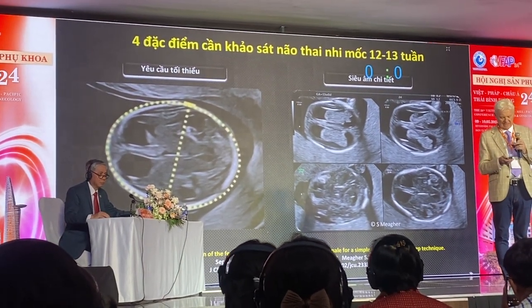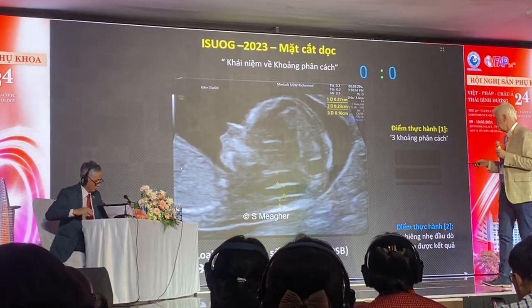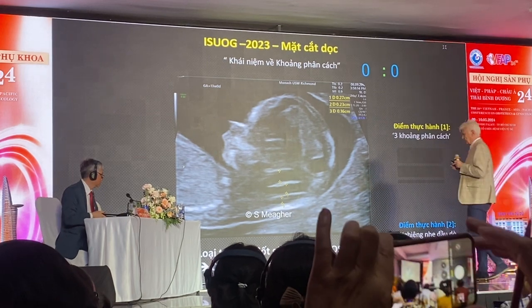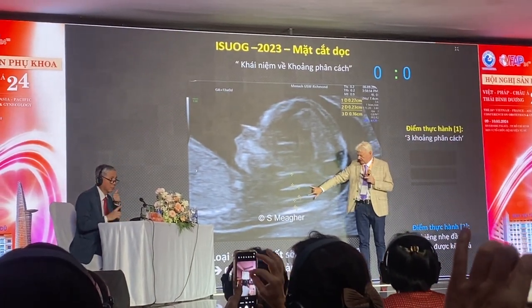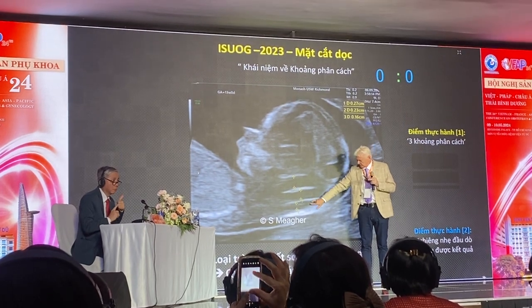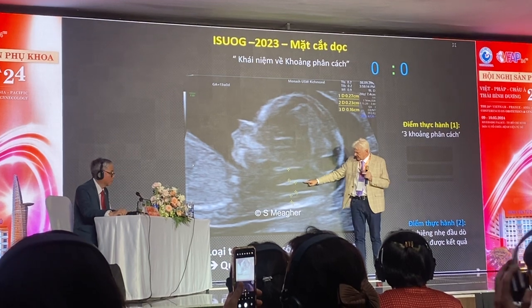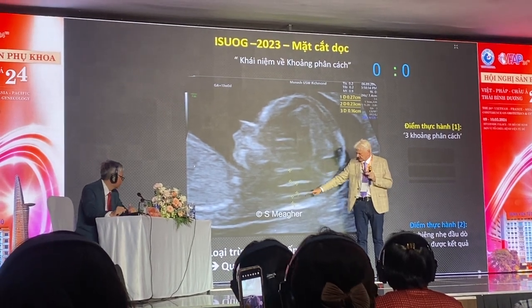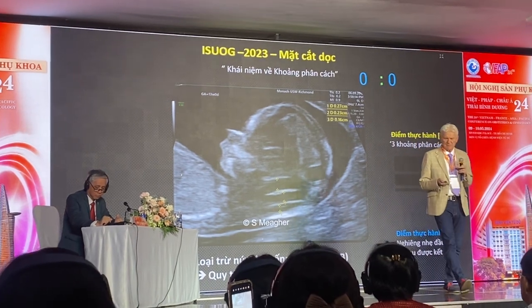That's a detailed scan in the first trimester. Next, we look at the sagittal section. On the sagittal section, we measure here the brain stem, we measure here the intracranial translucency, and we measure here, which is the cisterna magna. And here we take the distance from the posterior border of the brainstem to the inner border of the occipital bone as a screening test for spina bifida.